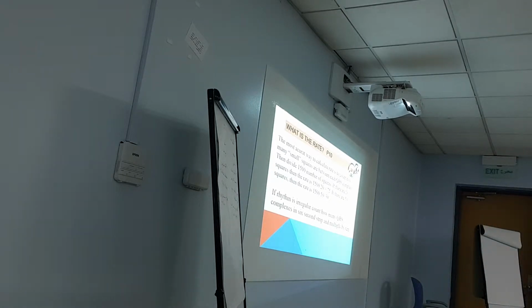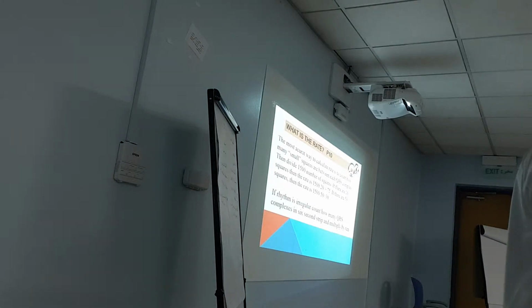But sometimes irregularity starts gradually. Maybe the irregularity is slowly appearing in your ECG and it's very fine. You need to really measure it and count, and you will find maybe one small square is different, or two small squares. Until you see it by your eyes, too late. Yani it's already started long time before. So you can identify regularity by measuring.